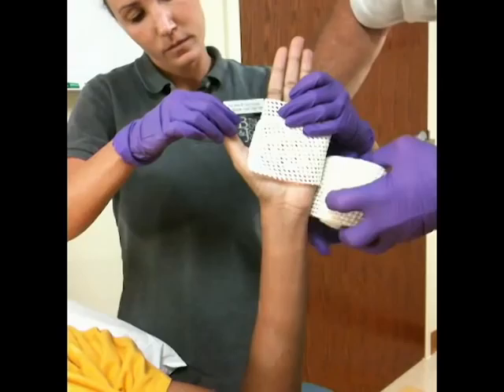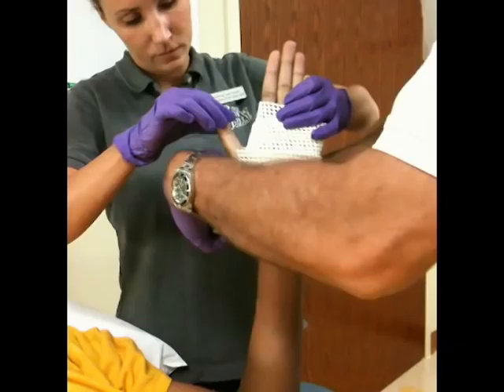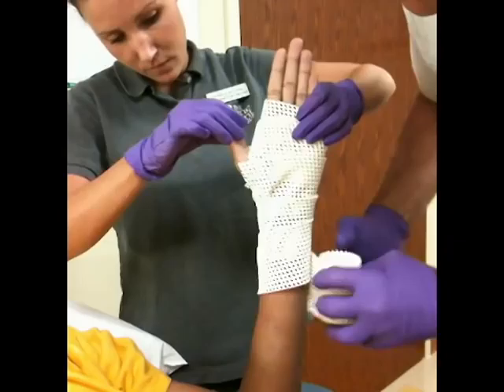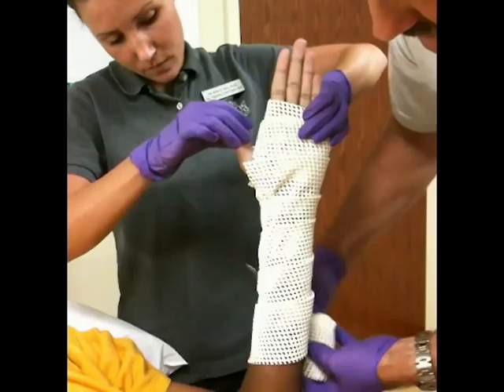Then we wrap it around the back of the hand. Another cut is made on the top half, again to allow for the thumb. The material is then folded over itself and overlapped about 50% as you wrap down the arm.